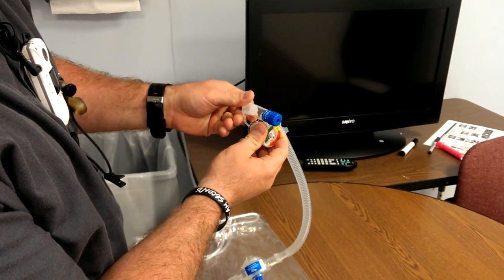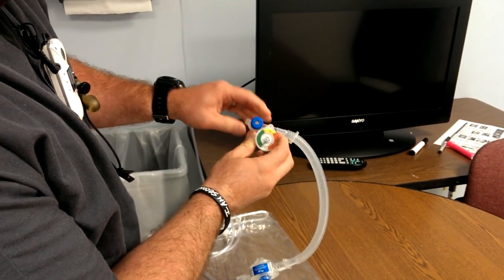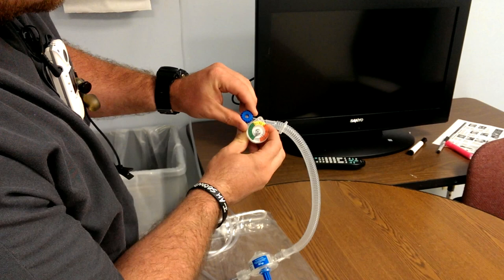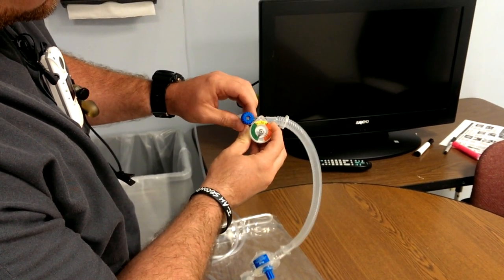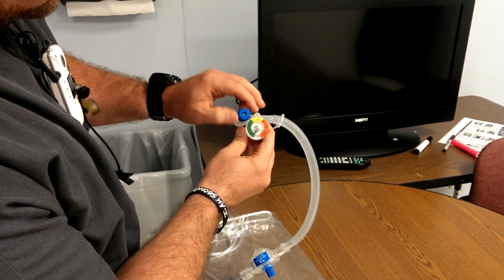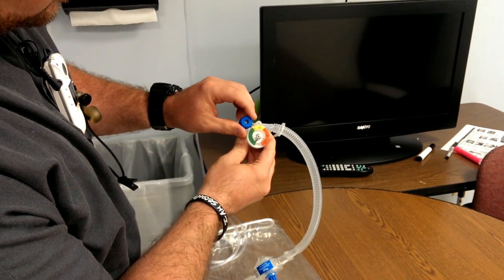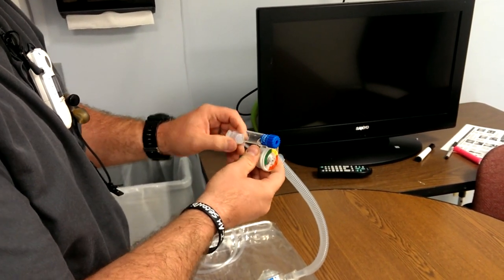Now we set our PEEP. You occlude it the same way — put the cover on here and turn this knob until you see your manometer start to come up. You can see it came up from 0 to close to 5. That would be good. So 25 over 5 is kind of what you're looking for as initial settings.